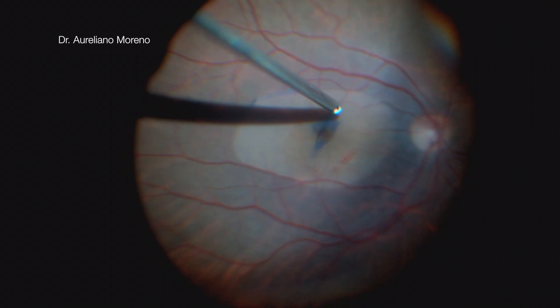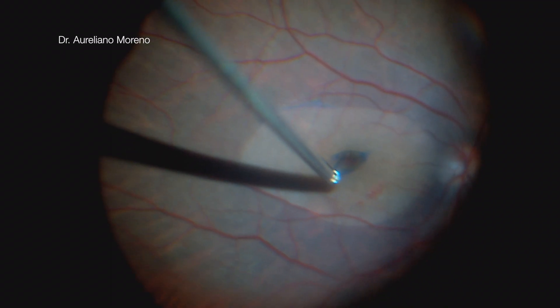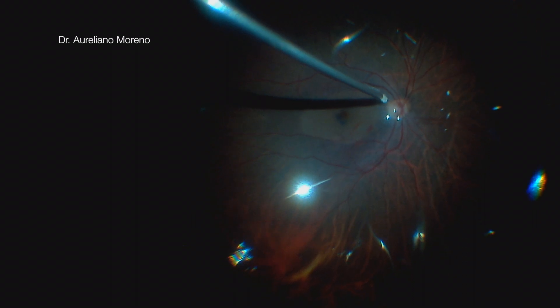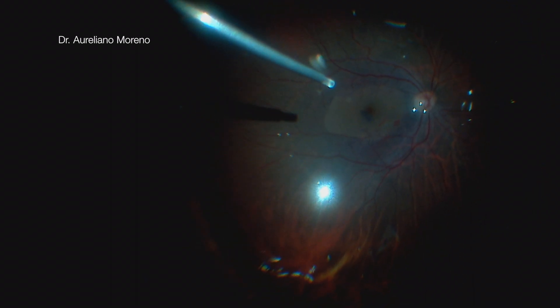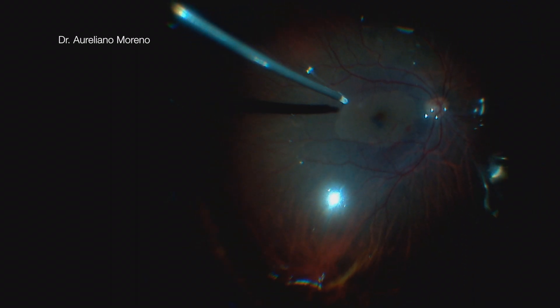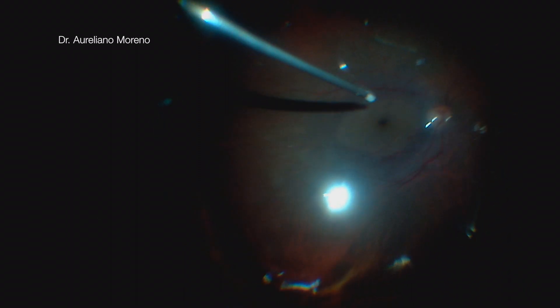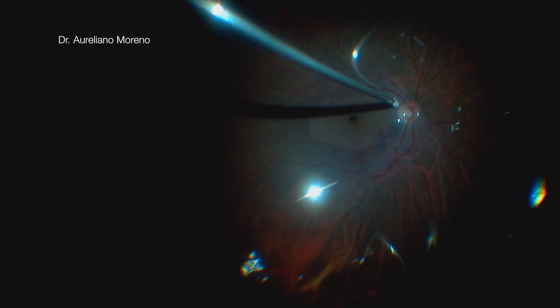Using a low vacuum and low cut rate, I trimmed the flap to the size of the macular hole. During the fluid-air exchange, you can reposition the flap by decreasing the intraocular pressure and aspirating the liquid near the fovea in the direction you want the flap. But remember to never touch the macular hole.